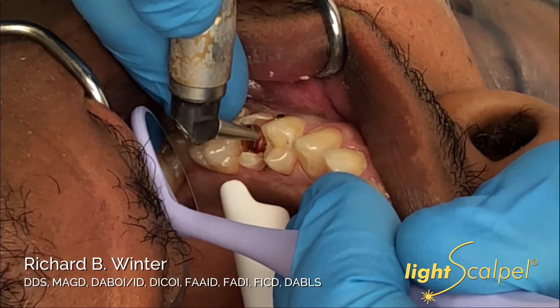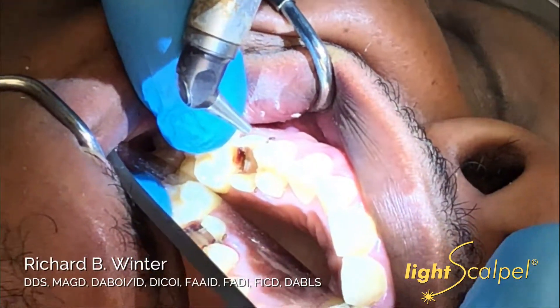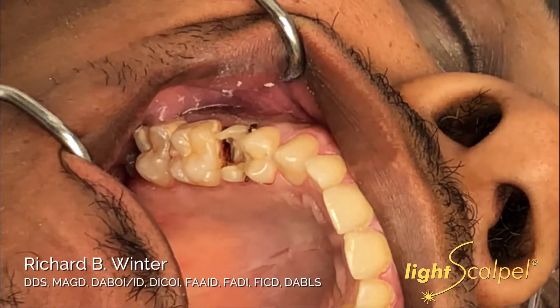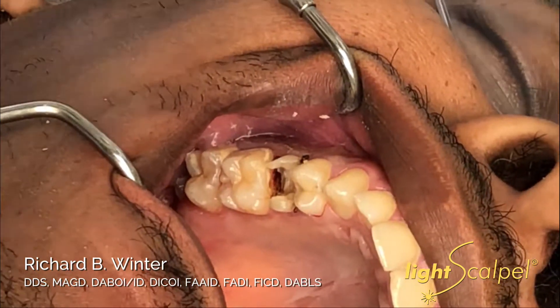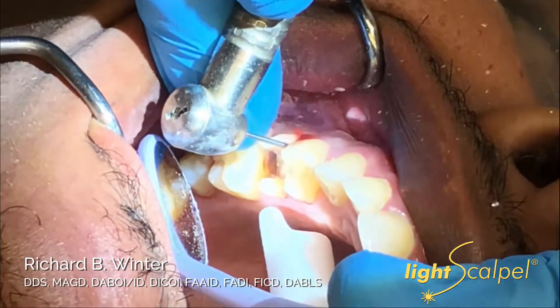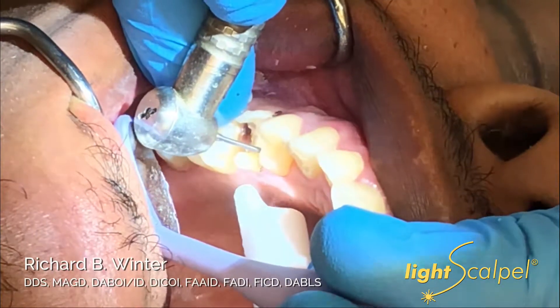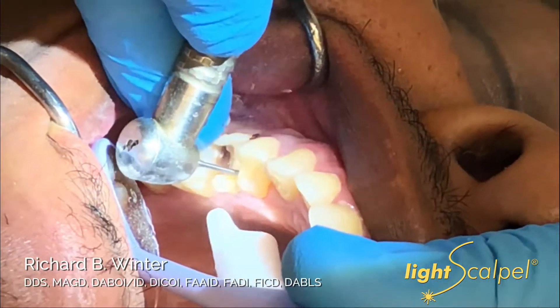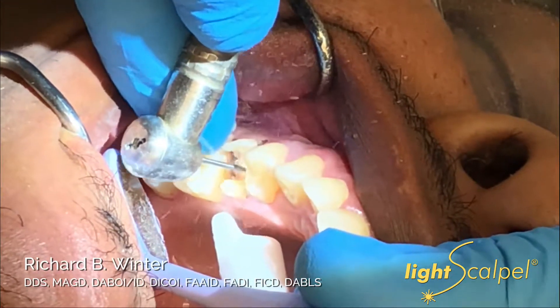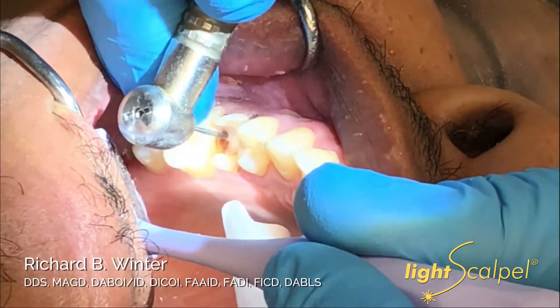You can remove a little bit of tissue on the adjacent tooth and create a little bit of a bevel as well. Then we're going to take our 170 XXL bur and go right into the little trough area. We just want to remove enough so we can maintain biologic width — we want to make sure there's about 2.04 millimeters, as put in the textbook. We can also go back over the tooth structure itself and remove that little bit of char.